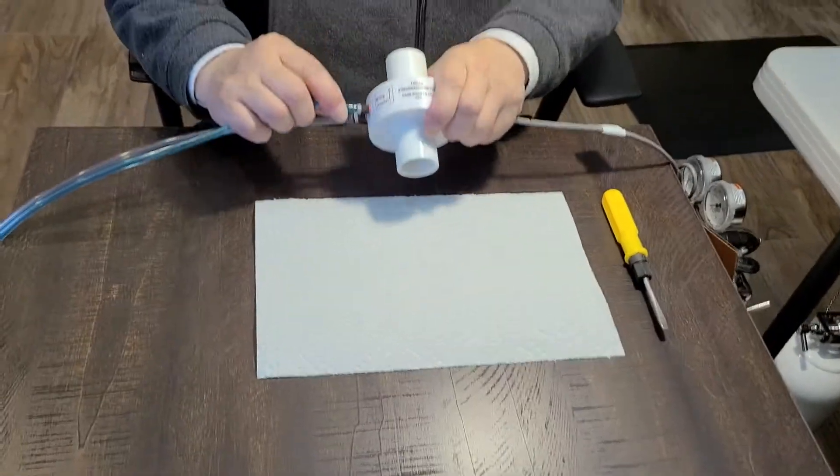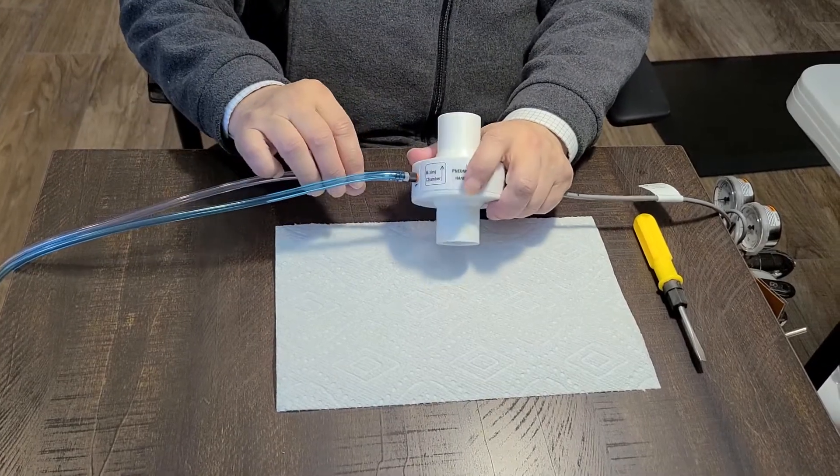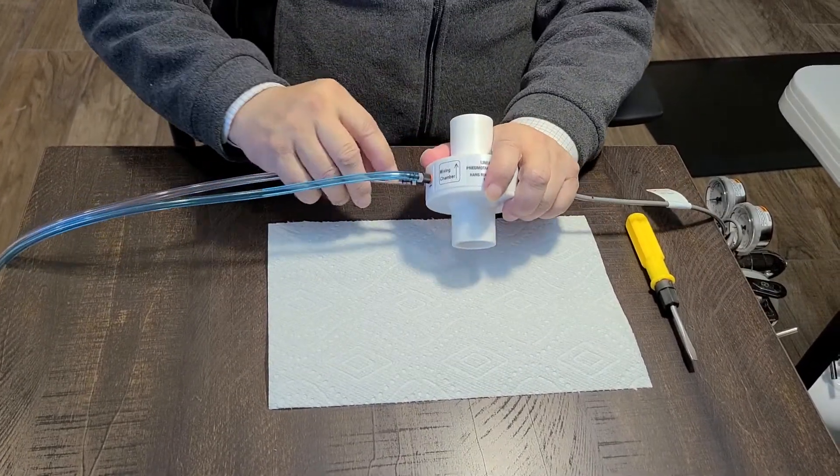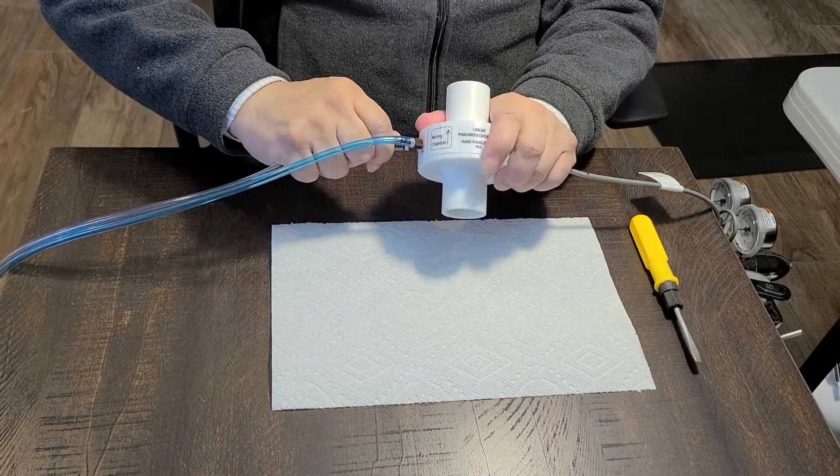The first step is we pull the blue clear tube off from the pneumotech. You need to use force and you can turn slightly clockwise.